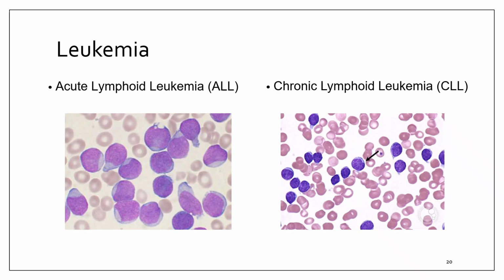You'll see numerous small mature lymphocytes, clumped soccer ball chromatin, minimal cytoplasm, and occasional smudge cells. That arrow is pointing to a classic lymphocyte. Nothing dramatic, nothing flashy, which is exactly why CLL often flies under the radar. So an important distinction: in CLL, the cells look mature, but they are functionally incompetent. So the immune system looks crowded, but performs poorly. Quantity does not equal quality, okay?